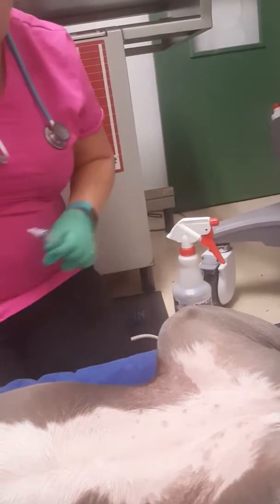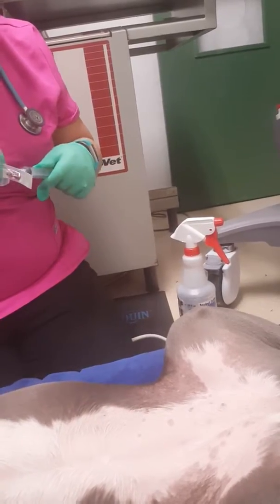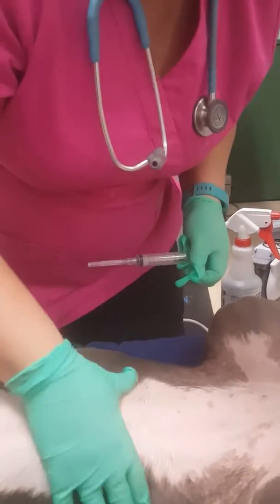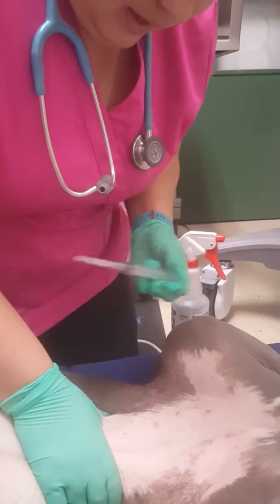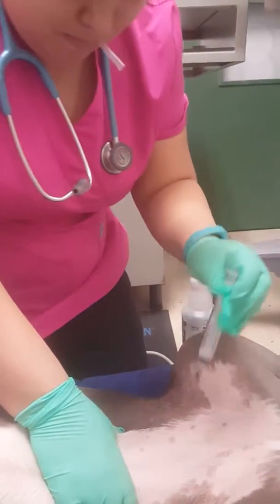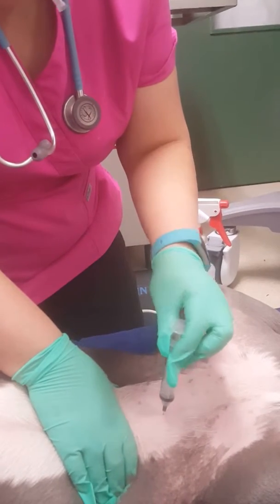I'll get my sterile syringe and my sterile needle. What I'm going to do is feel for that bladder — got it nice right there. I'll poke right on the midline.